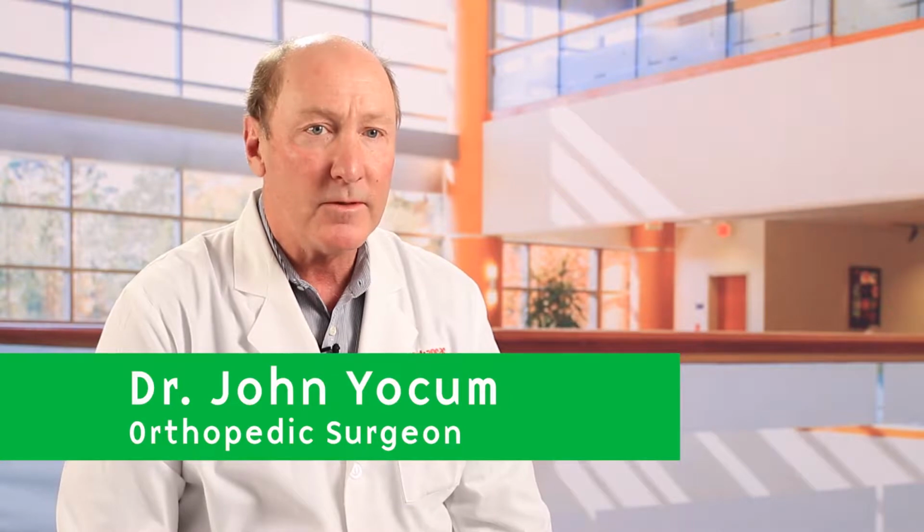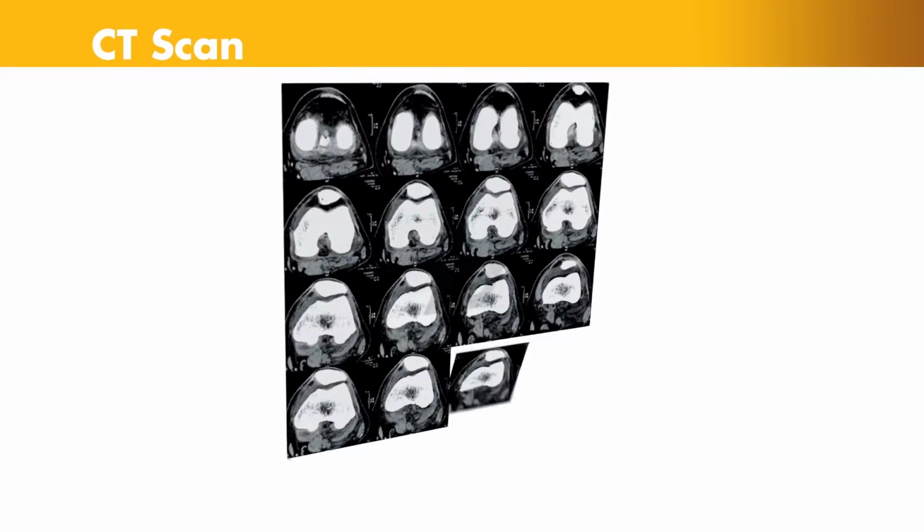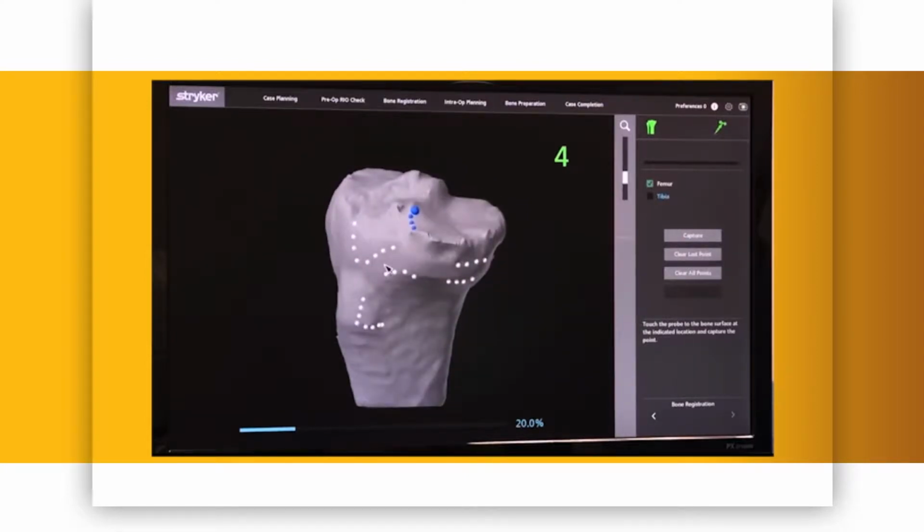The Mako Robotic system is used for replacement of total knees, partial knees, and also total hip replacement. We use a preoperative CT scan of the patient's knee to make a virtual 3D model of the knee that allows us to create a plan preoperatively, before we ever go into the operating room, and plan the cuts that we're going to make.